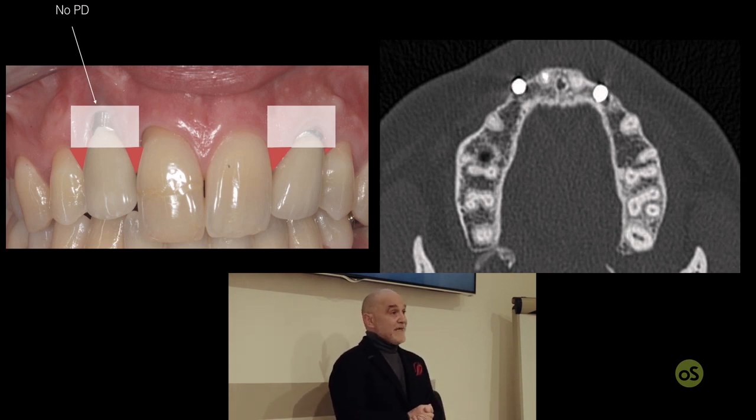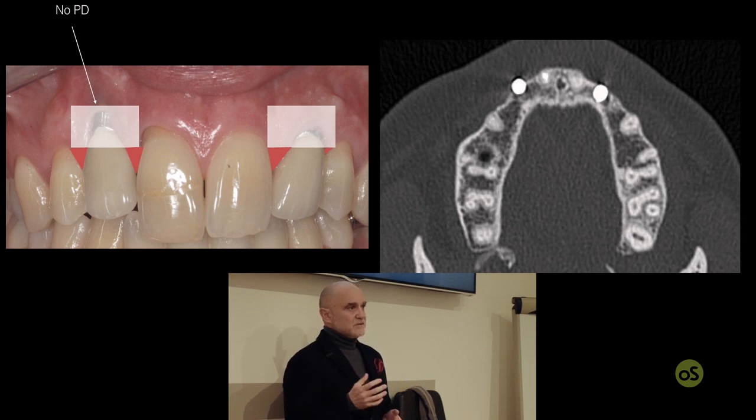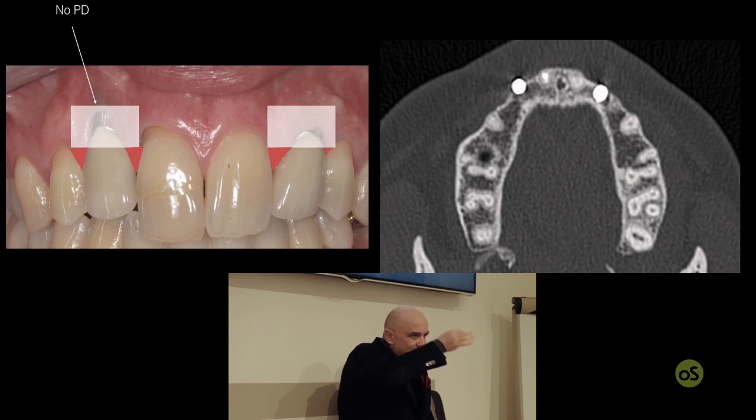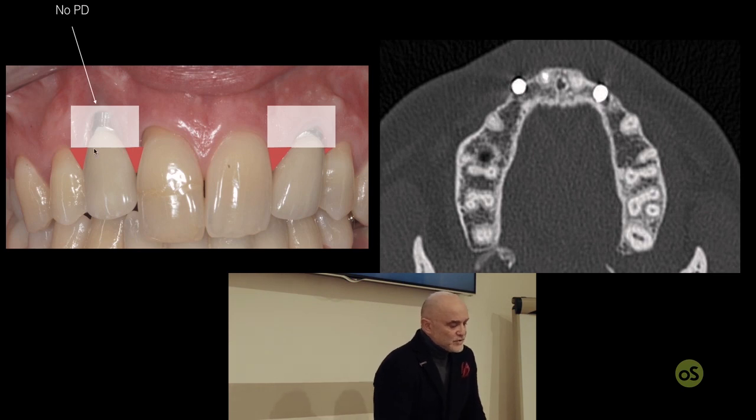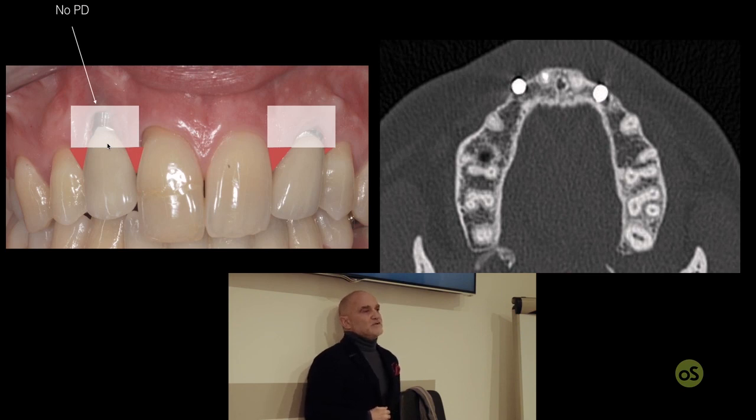And in order to augment soft tissue thickness enough, more than 2 millimeters, we have to use a connective tissue graft for sure. And this connective tissue graft should be used in order to replace the soft tissue margin in the ideal aesthetic position, but with a greater thickness. So where should the connective tissue graft be applied in terms of apicocoronal position?